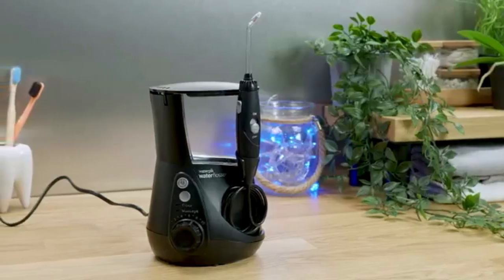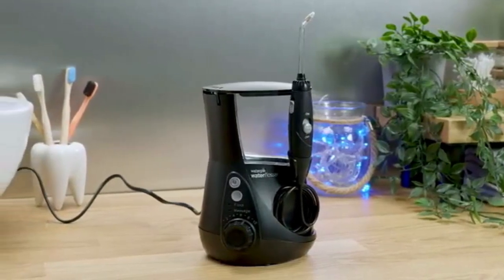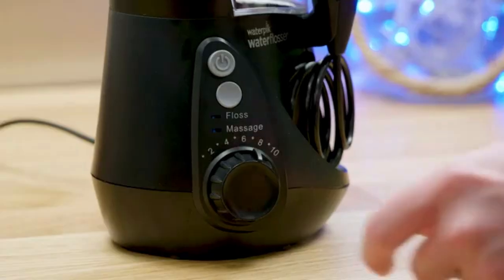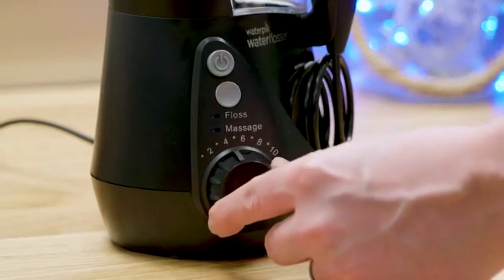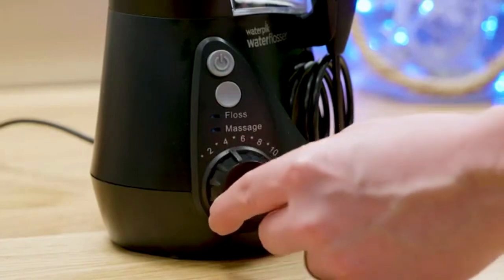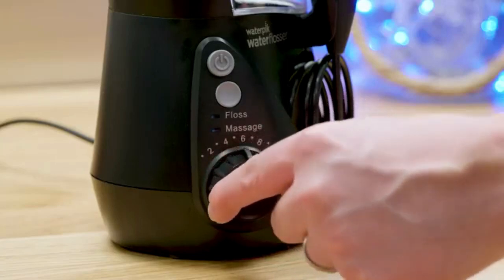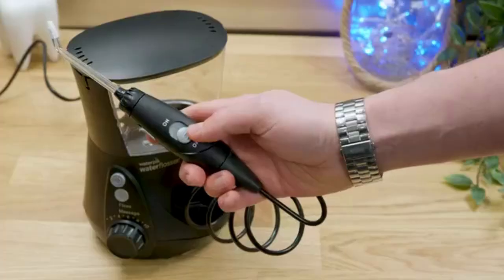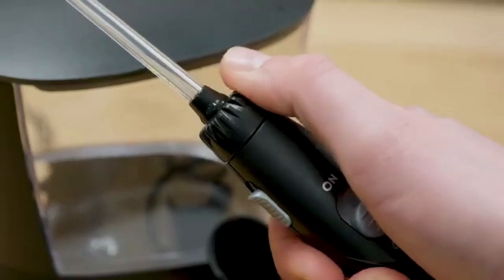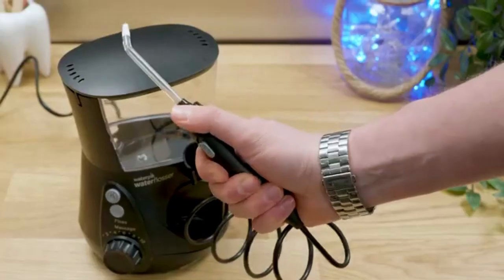Place lukewarm water into the 20oz (600ml) reservoir and the pump will draw the water from it and out through the interchangeable nozzle at the top of the handle. Use the easy-to-rotate dial on the left side of the device to change between the 10 different pressure settings, ranging from 10 to 100 PSI. Setting 10 is a pretty intense setting — most will find around 6 to 7 to be most comfortable. Control the water flow with the on/off slider switch on the handle and rotate the nozzle a full 360 degrees if required to position the tip to the perfect position in the mouth.